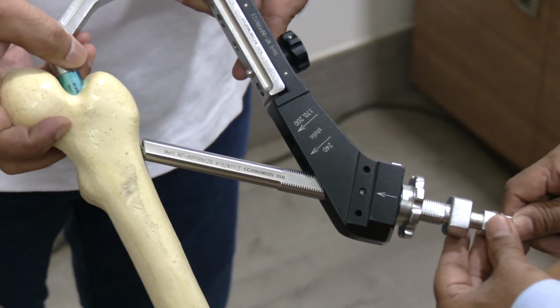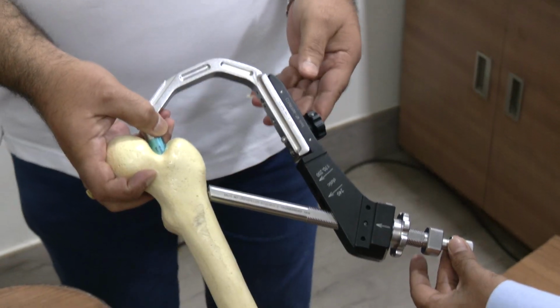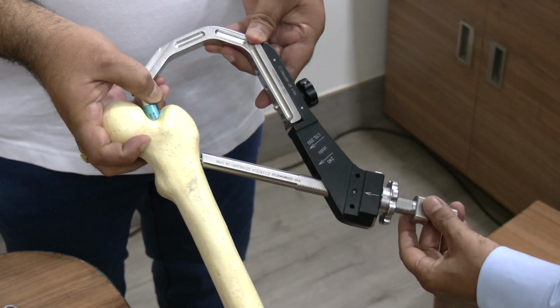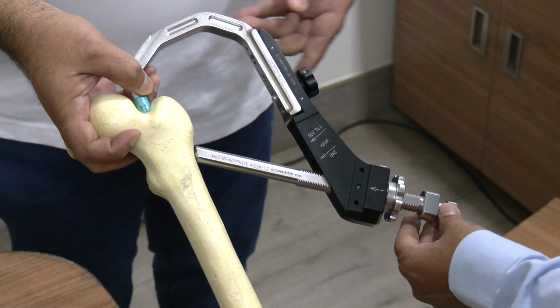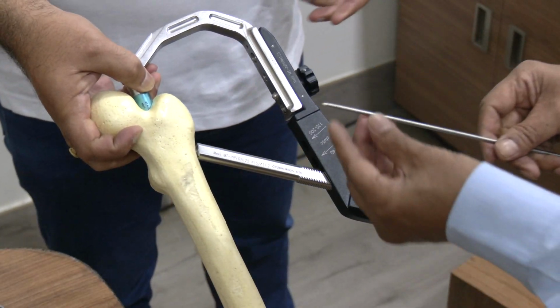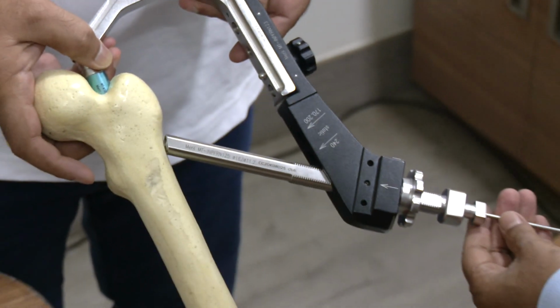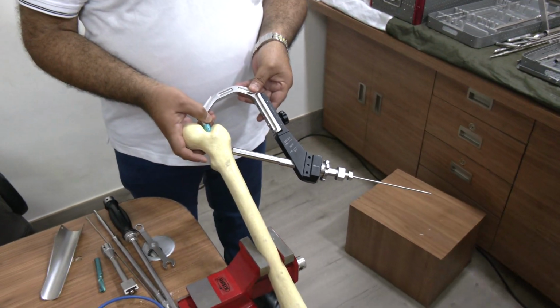Now I am making a dent in the lateral cortex with this trocar. This trocar makes a hole in the lateral cortex so that my guide wire passes through properly without any problem. So now I am passing the guide wire. This guide wire has threads at the tip. It's a 3 millimeter guide wire. It is a strong guide wire. It won't bend or deflect while you are passing. Then you pass the guide wire, and with the help of the reamer, you can pass it.